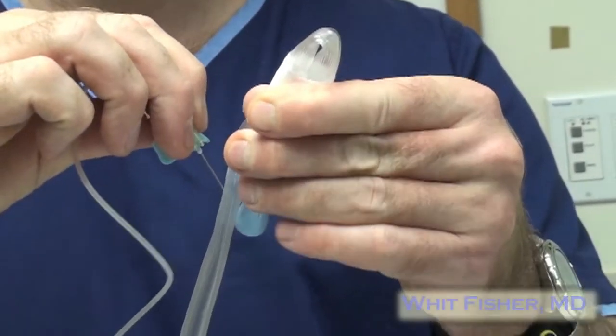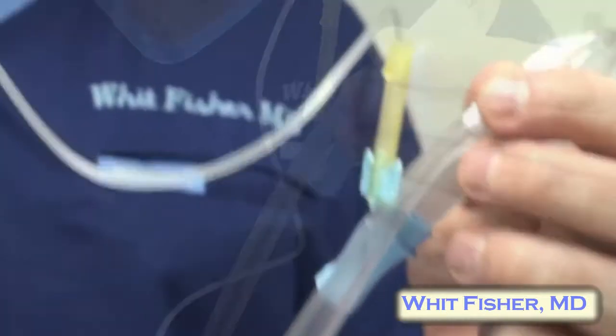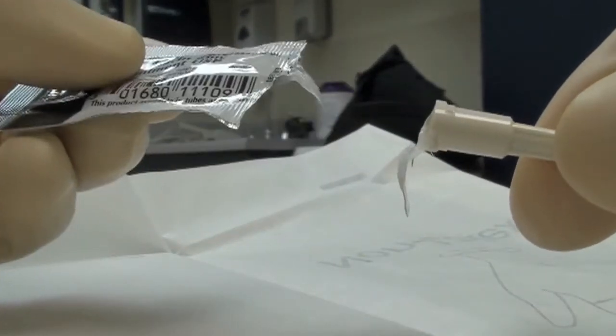Take the specimen needle and pierce the suction tubing. You can see this creates a lot of suction at the other end of the butterfly tubing. You can put a little bacitracin ointment on the outside just to help create a better seal.